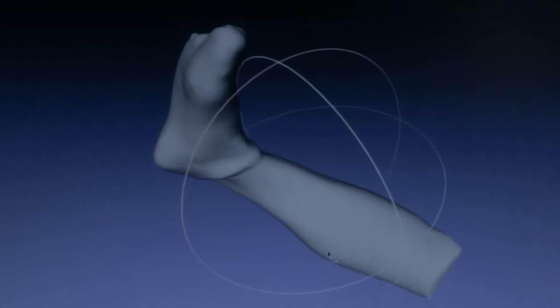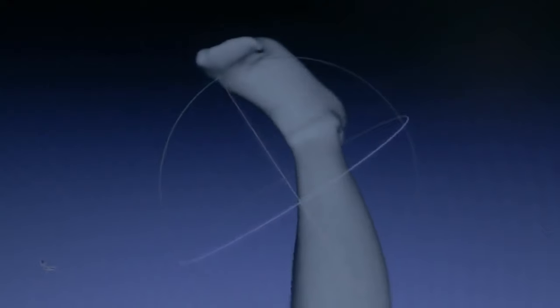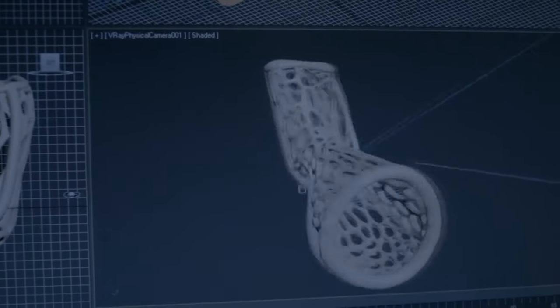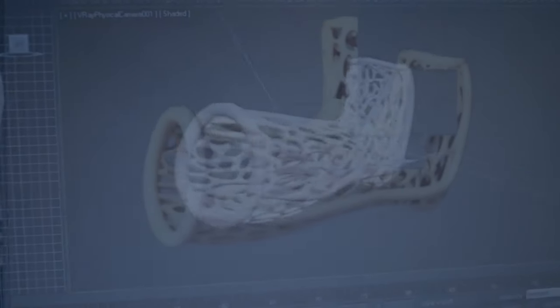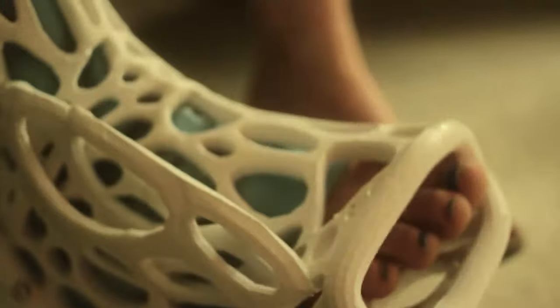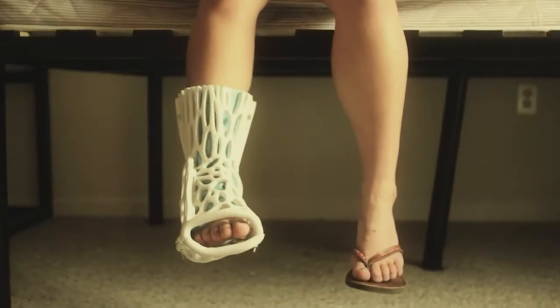Also, the use of orthoses for the treatment of leg fractures is still difficult. Leg orthoses are comparatively larger and more inconvenient than their counterparts for treating hand fractures. The casts make it difficult to wear socks and shoes, and some of them are more restrictive.